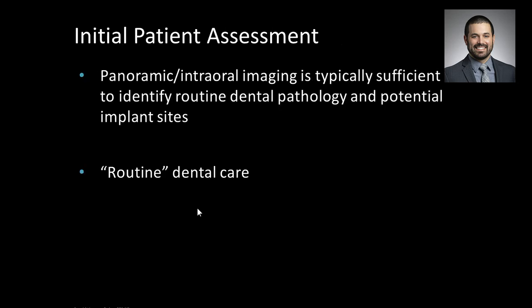So let's start with the initial patient assessment. This is what I call routine dental care. The patient comes in the door, and the best imaging recommendation is a panoramic and indicated intraoral imaging, be that bitewings or periapicals, to identify your routine dental pathology and any potential implant sites.